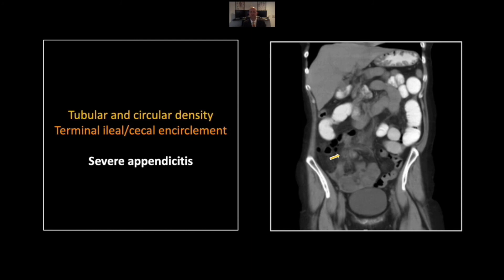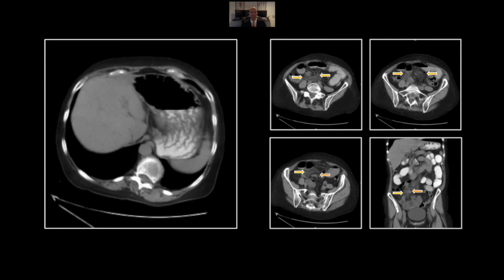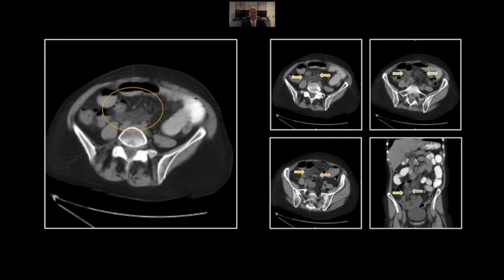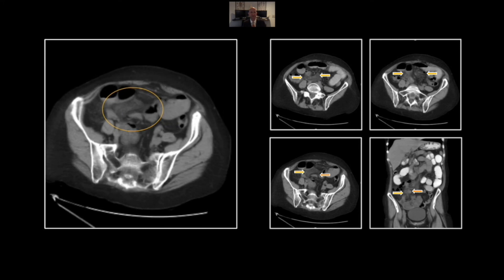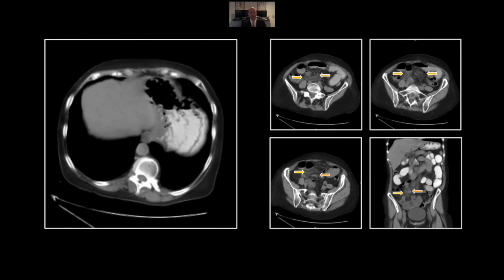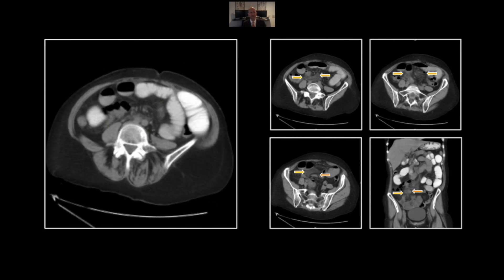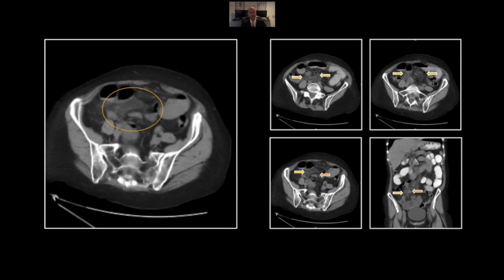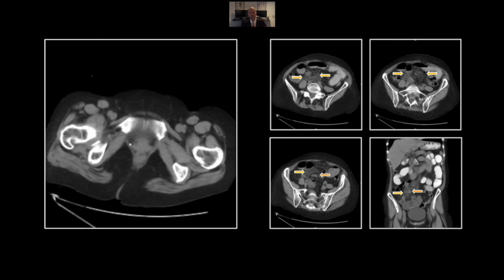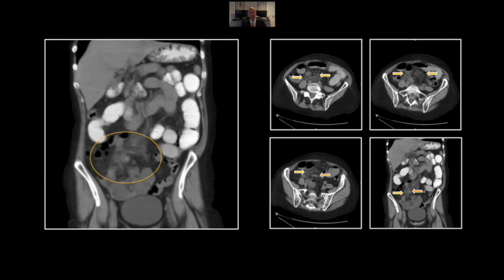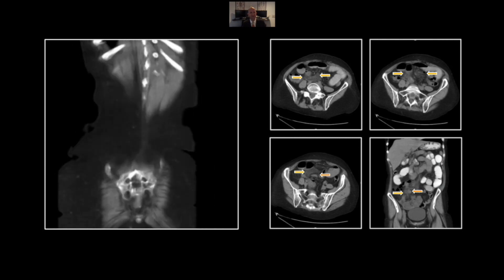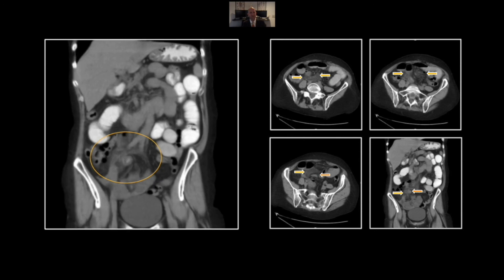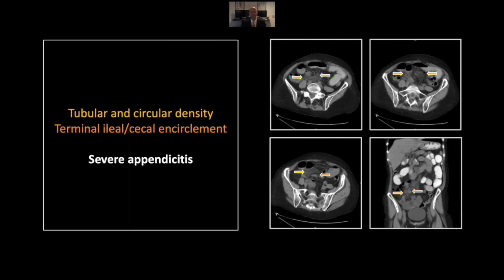Here more posteriorly, the top portion of that arc of the appendix is visible, and again the terminal ileum compressed by the encircling appendix. On the cine, appreciate the dilated bowel loops, the top portion of the appendix, and its bottom portion encircling the terminal ileum and causing that obstruction. On the coronal, it really allows you to appreciate the circular configuration of that swollen appendix. So that is a severe appendicitis — I think as bad as appendicitis can get without perforation.